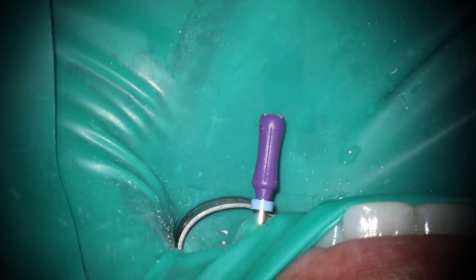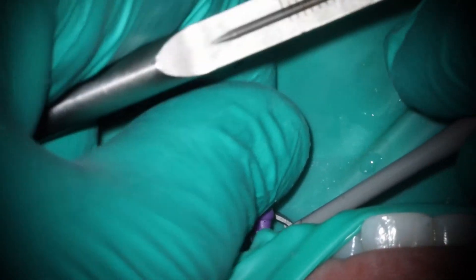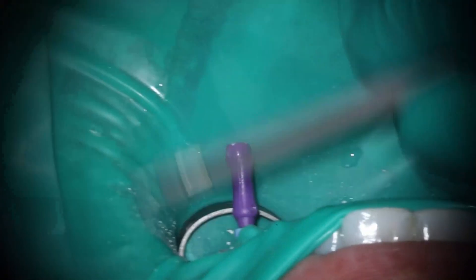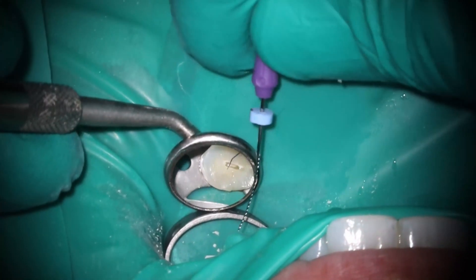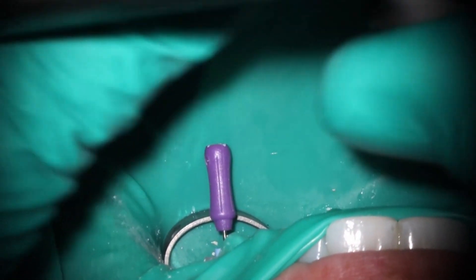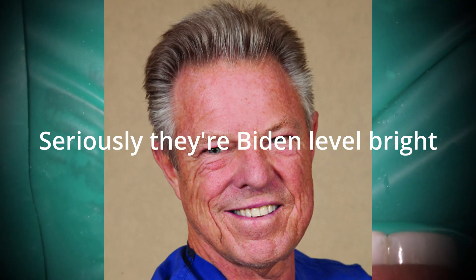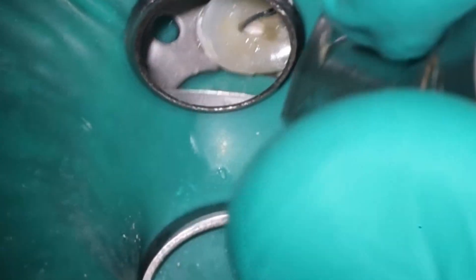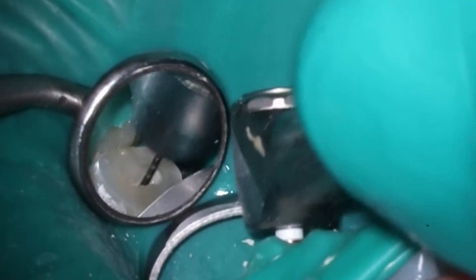I'm still trying to figure out a way to make the working length step slightly more efficient. I think I forgot to turn it on or forgot to put the lip clip on — that's why there's a slight delay. Actually having the room ready, Scott, would be a great way to make it more efficient. You can see the slight bend on the file — I put a slight bend on all my files before they go into the canal. This is something I learned at Apices my first month of residency; John West showed us that when you hand file, you want that gentle curve. For the vast majority of my cases, there's going to be a gentle curve on the file, because it makes a huge difference for getting around curves. Gentle curves are the way to go.